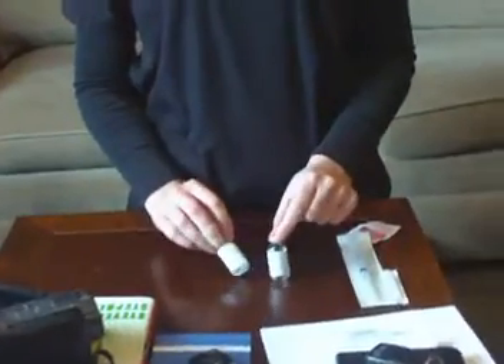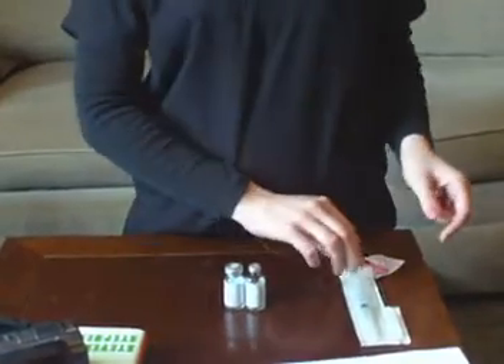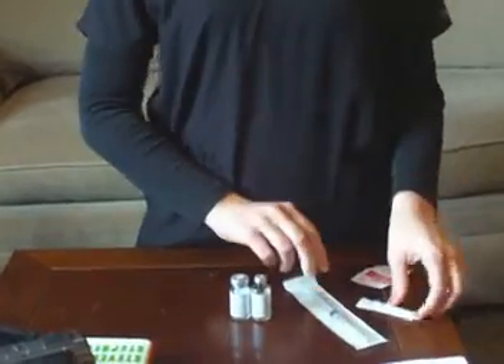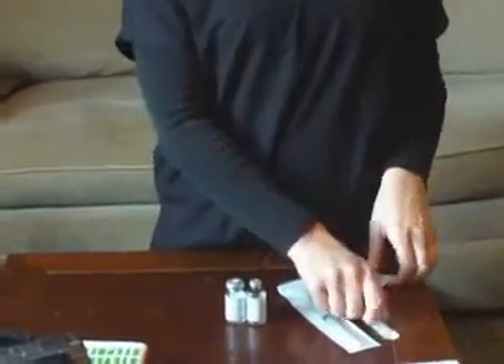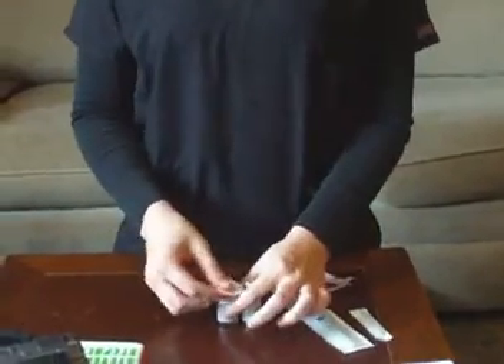We'll start with our HCG vial of powder and water. And then we have our syringe with a 22 gauge needle, and then we have a 27 gauge needle. So we'll start by cleaning off the tops of both bottles.